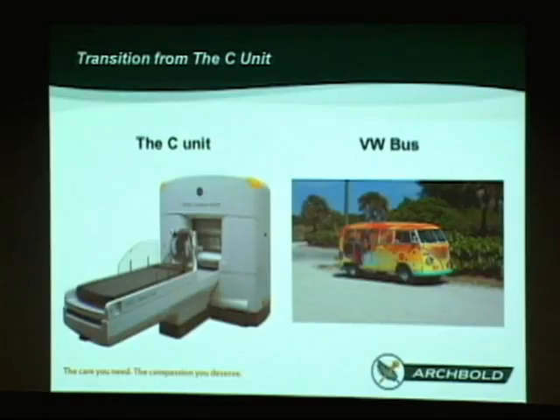There was a lot of mechanical interaction between the team, and I mean the team, that's Janet, Ramesh, myself, Steve, Dave Saunders, and Craig Fredericks, the other neurosurgeon. So we've had a stable team for the whole time that the C unit was in place. And let me just show you the C unit again. In the C unit, you had these helmets here that we had to change. They were for different size shots.